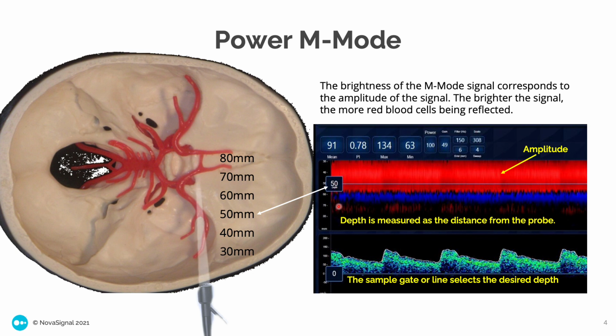The corresponding Doppler signal looks good as well. If we move this depth to the end of the ACA where the blue is getting sketchy, the Doppler signal would become sketchy.